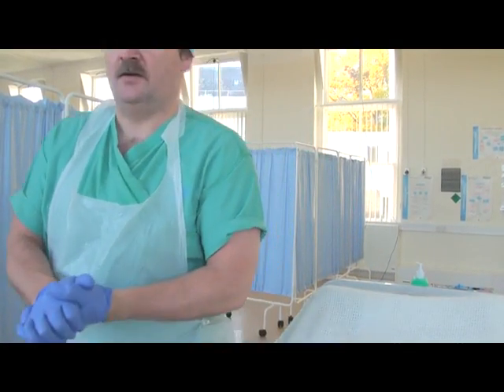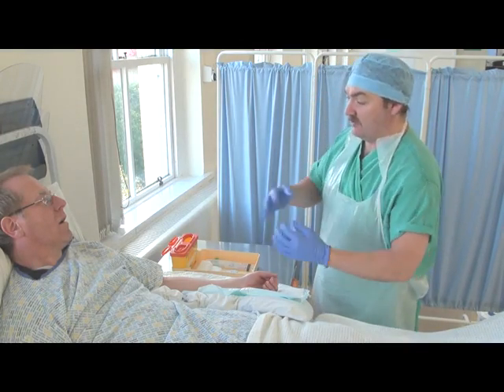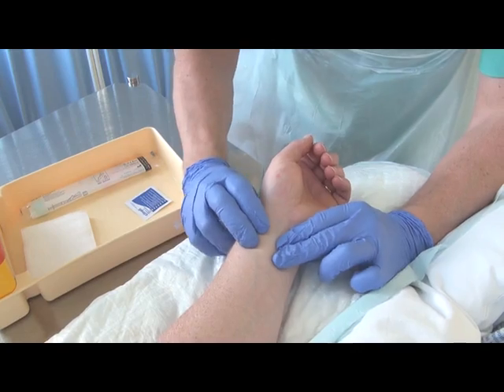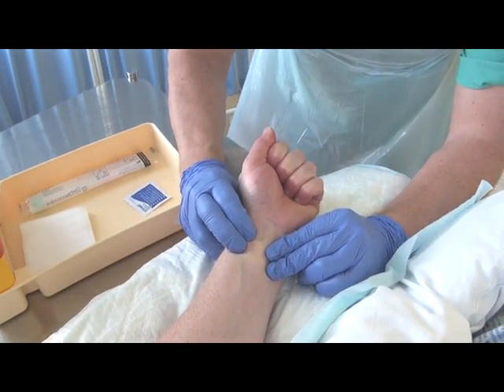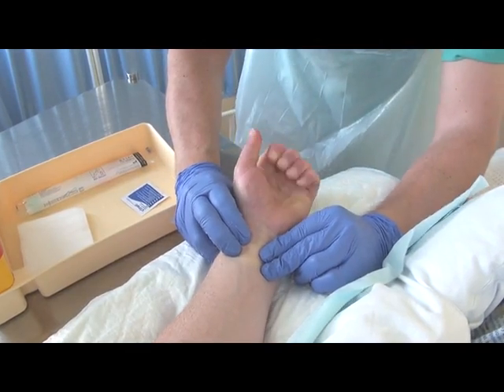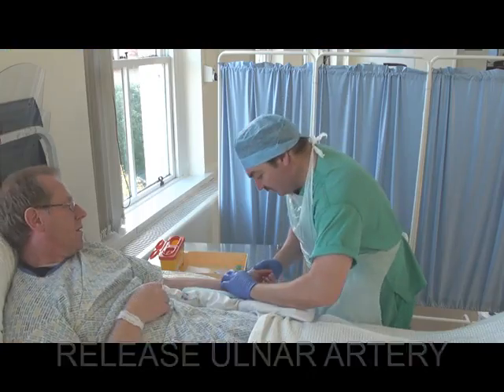The Allen's test should be considered as it tests the collateral circulation to the hands. Occlude the radial and the ulnar artery and ask the patient to make a tight fist. Ask the patient to open their hand flat, and if it pinks up within six seconds, circulation is fine.